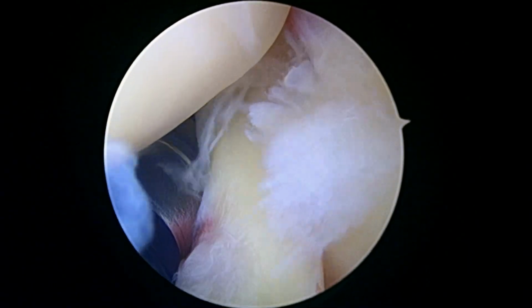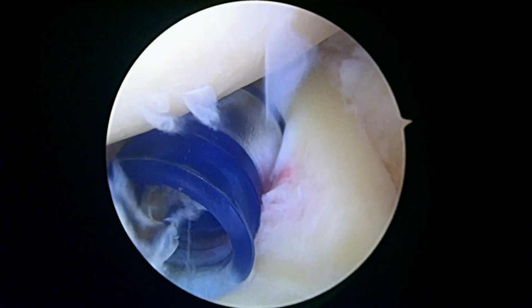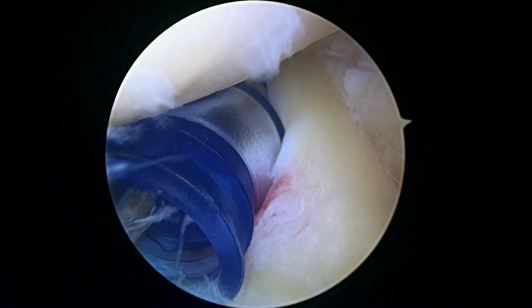All right, it's Dr. Buford, just getting started on the left shoulder. We're looking in from the back to the front. Everything you see is magnified 30 or 40 times on the screen.